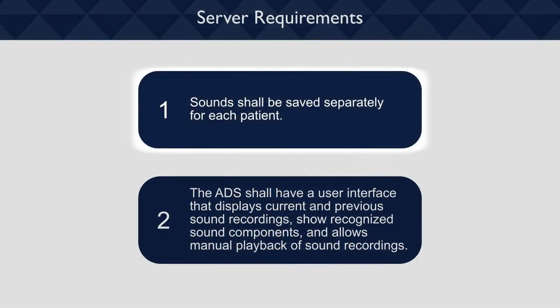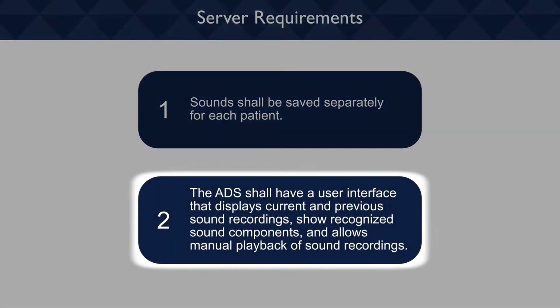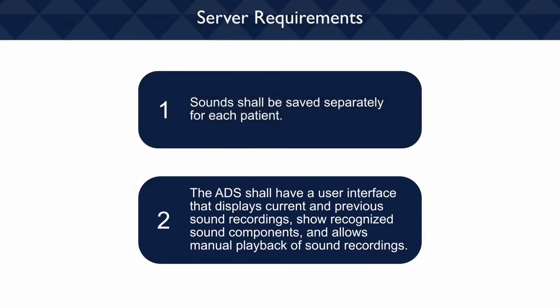The web app and server are the heart of the audio diagnostic system. With it, we can manage patients, connect to devices, and record, listen, and analyze audio. From the beginning, we established 2 primary requirements that the web app and server must meet. First, we declared that the sounds from the device must be sent to the server and saved privately for each patient. Second, we declared that the audio diagnostic system should have a user interface that enables the physician to view and play back audio files from the current appointment, along with audio files from the patient's previous appointments.